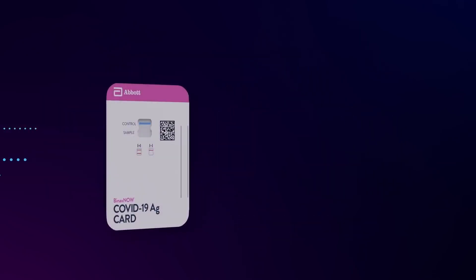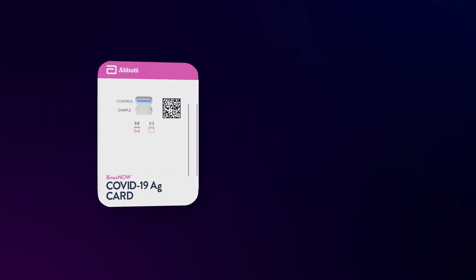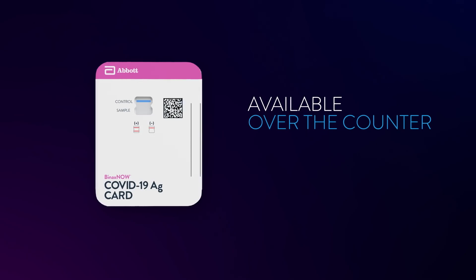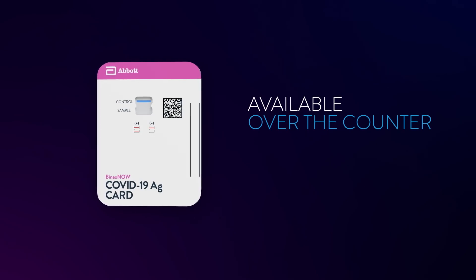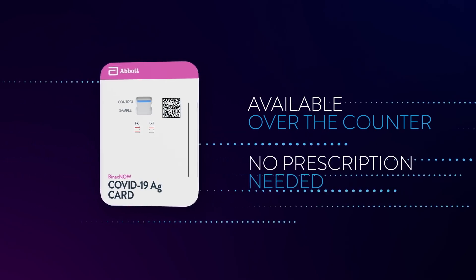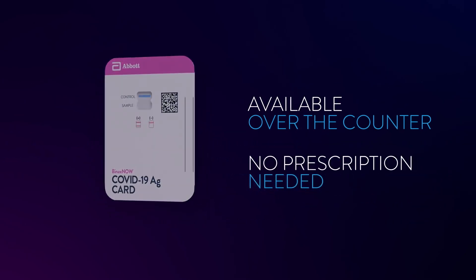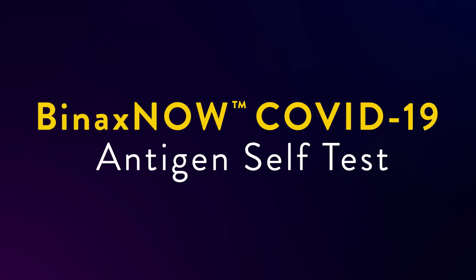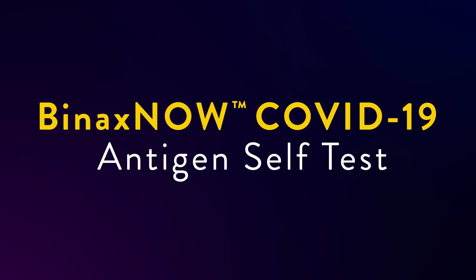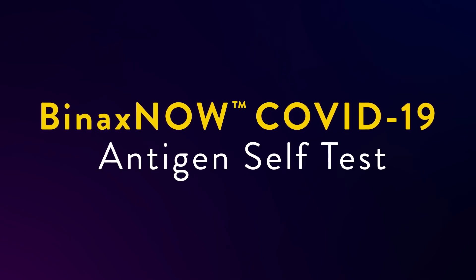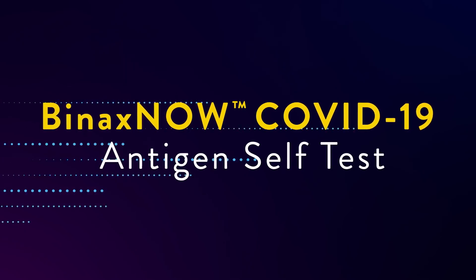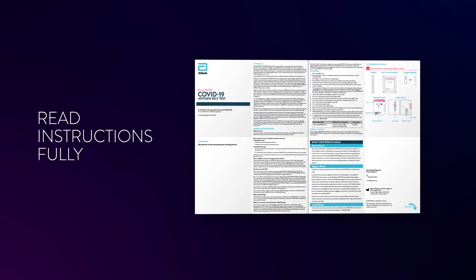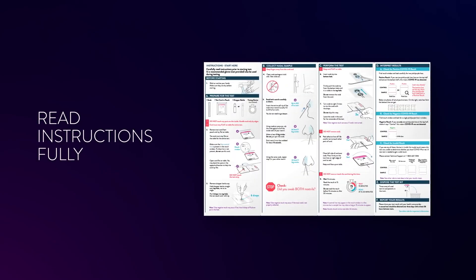The BinaxNOW COVID-19 Antigen Self-Test is conveniently available over-the-counter at a retailer near you. This video will show you how to use the BinaxNOW COVID-19 Antigen Self-Test. Before starting the test, carefully read the full instructions that are in the box.